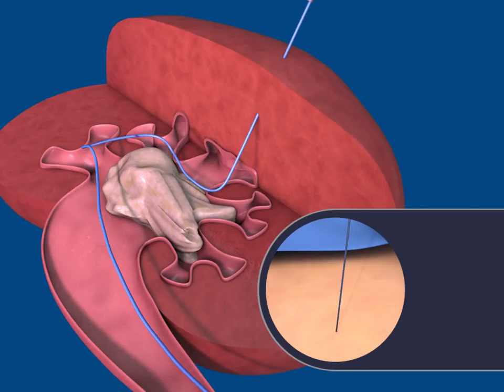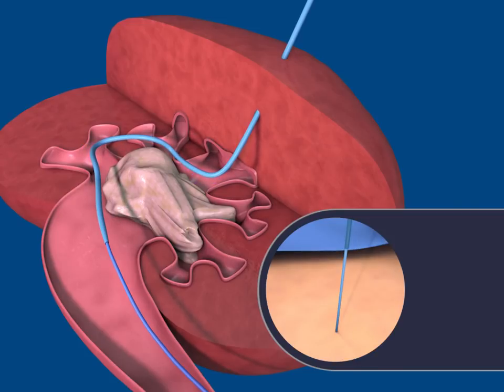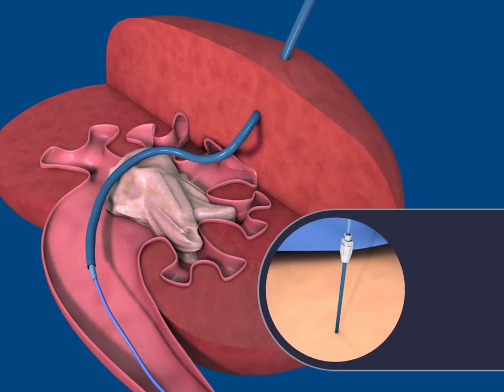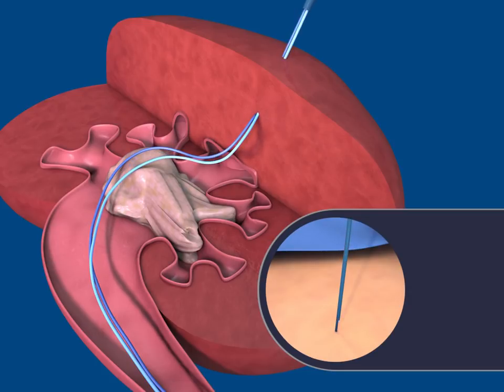Slide an 8-10 French dilator sheath over the guide wire. Slide the 8 French dilator past the stone and into the upper ureter. Slide the 10 French dilator past the stone and into the upper ureter. Remove the 8 French dilator. Insert the stiff working wire through the 10 French dilator down into the bladder. Remove the 10 French dilator.